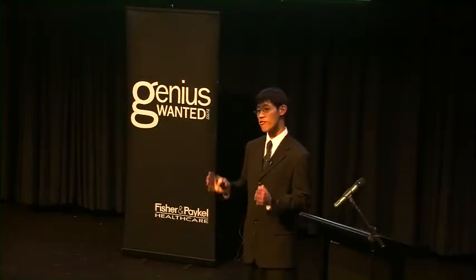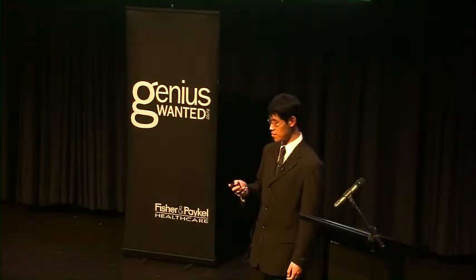And interestingly, no one has actually found a solution to this problem. The way that I'm going to approach this problem is to use a mathematical modeling approach, never been done before. The idea is that we can actually describe background phase very accurately using mathematical surfaces. For example, here I'm using a two-dimensional surface to describe the spatial distribution of background phase of the image on the left. And we can extend this idea into 3, 4, or even more dimensions.